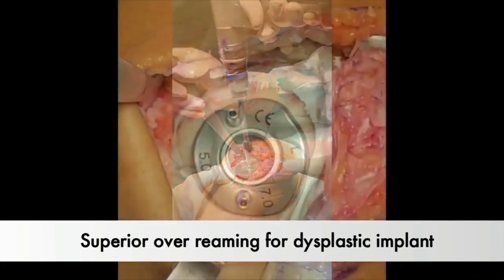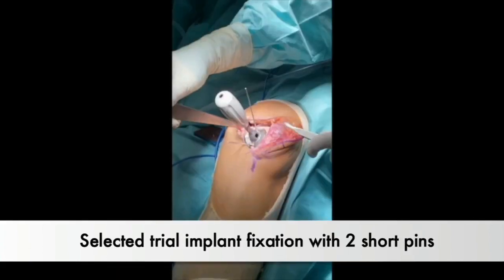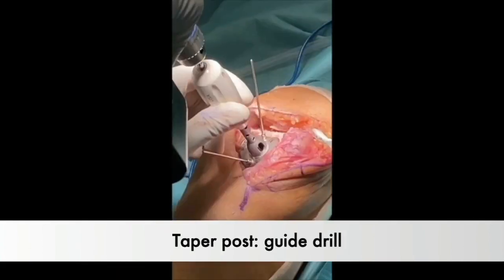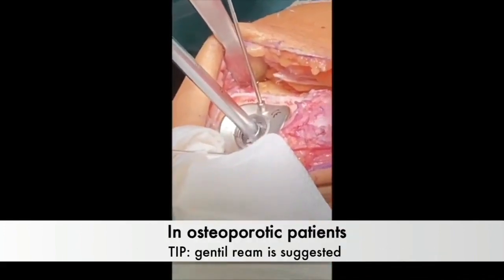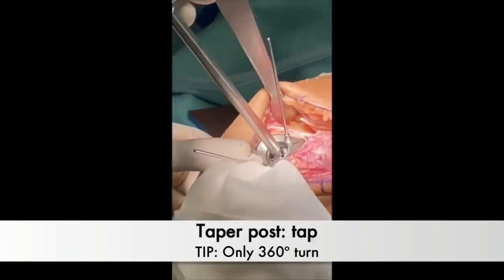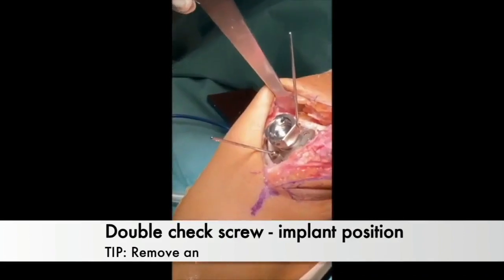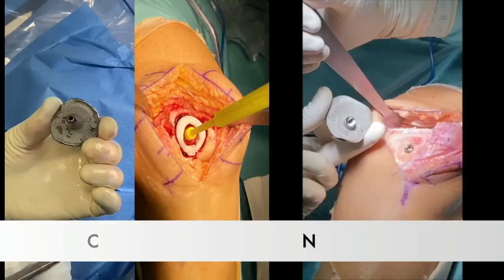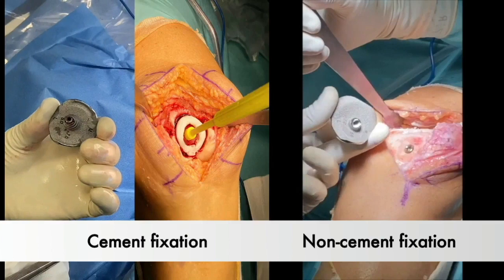This slide shows visual comparisons illustrating the distinct bony resection areas between the standard and dysplastic inlay implants. The appropriate trial implant is selected and securely fastened with two short pins, followed by preparing the tapered post bed using the drill guide, the step drill, and the tap. The tapered post implantation follows with verification of correct positioning using a placement gauge.